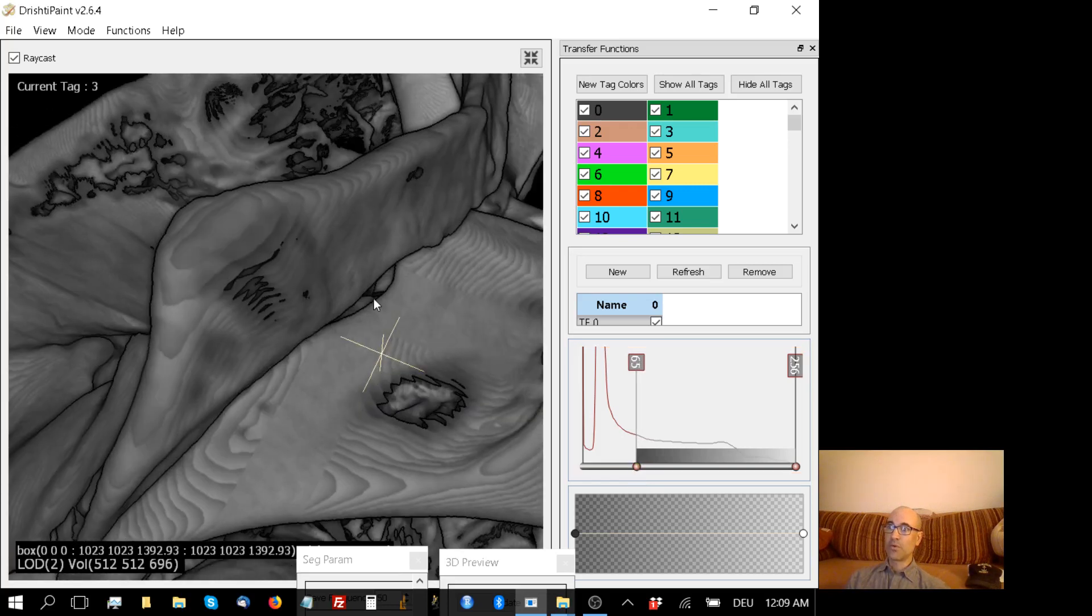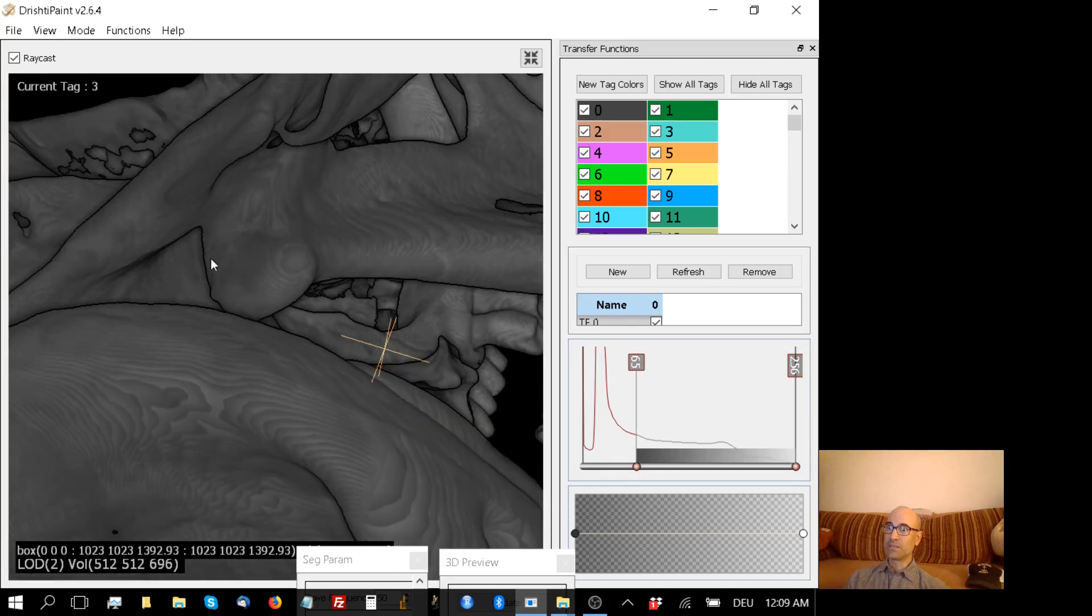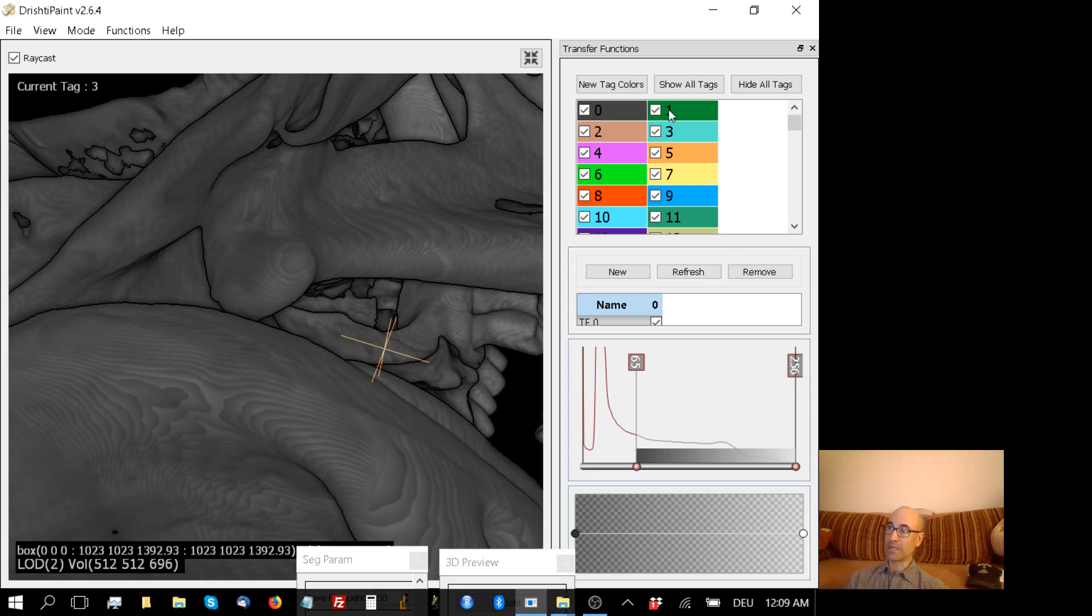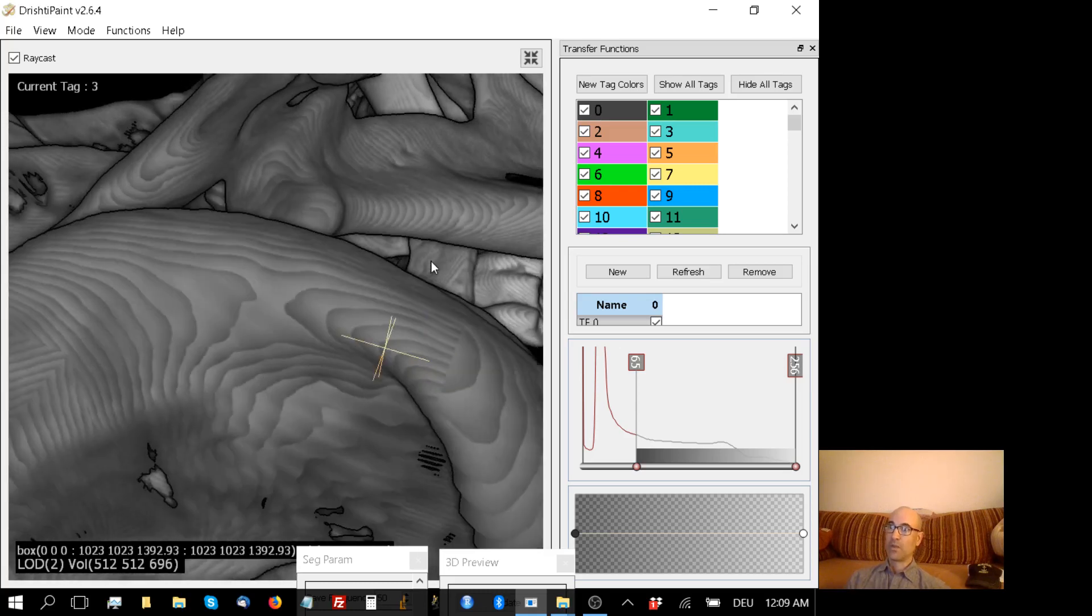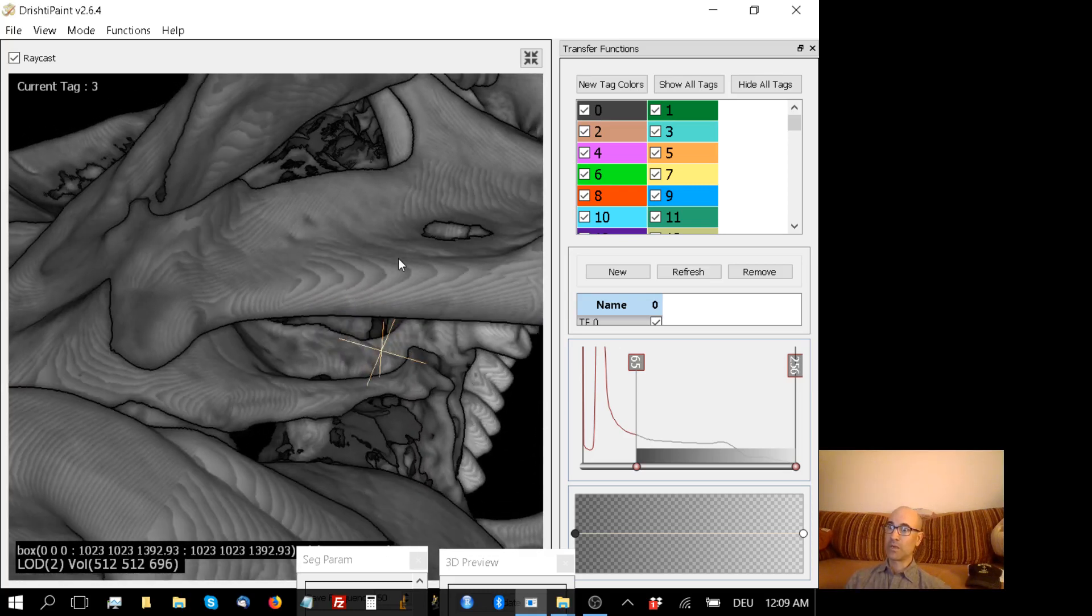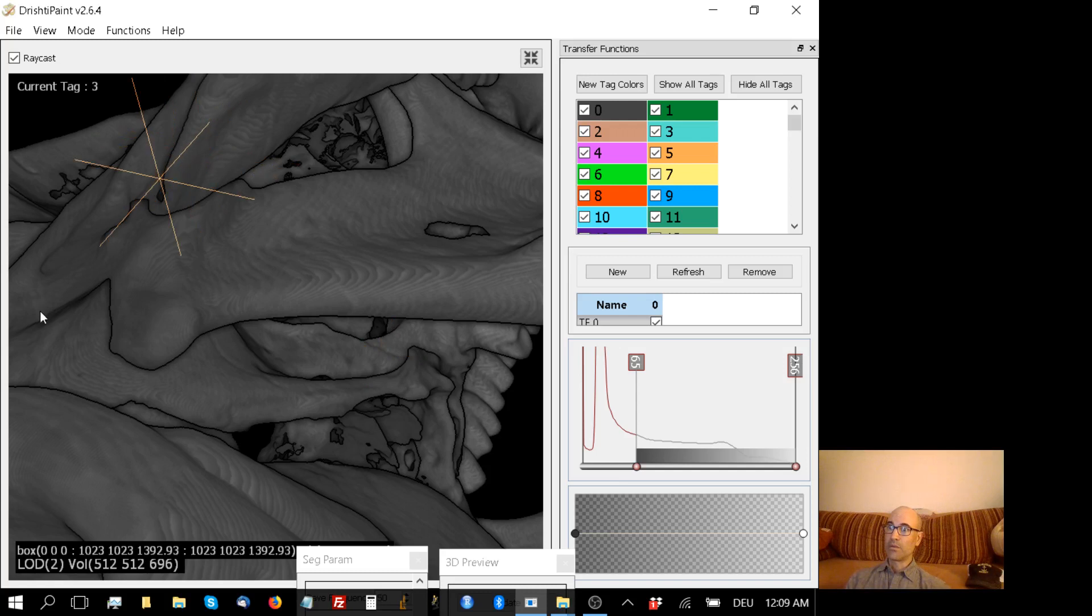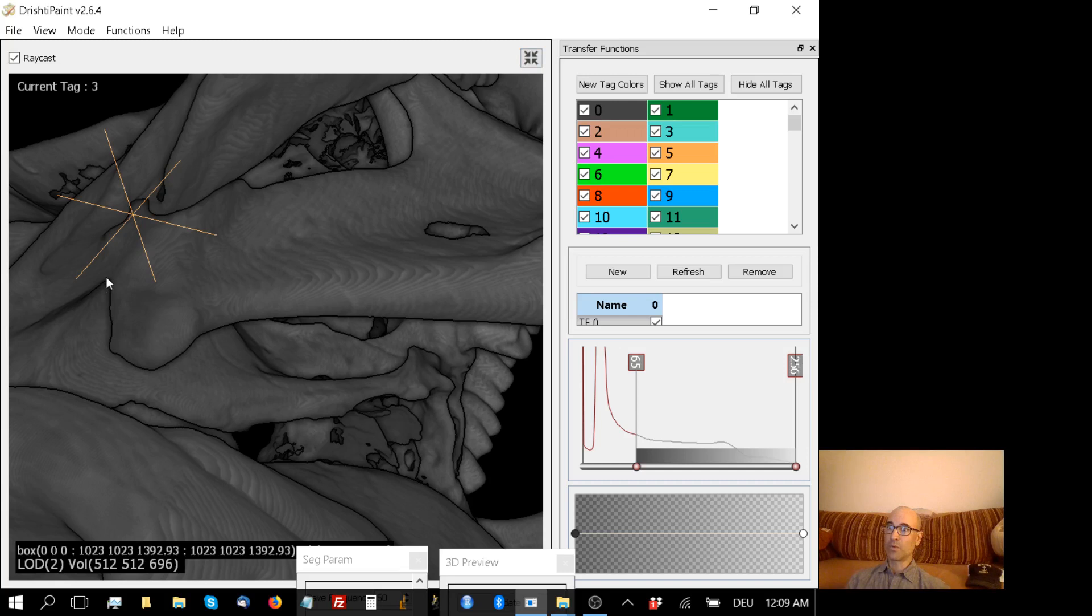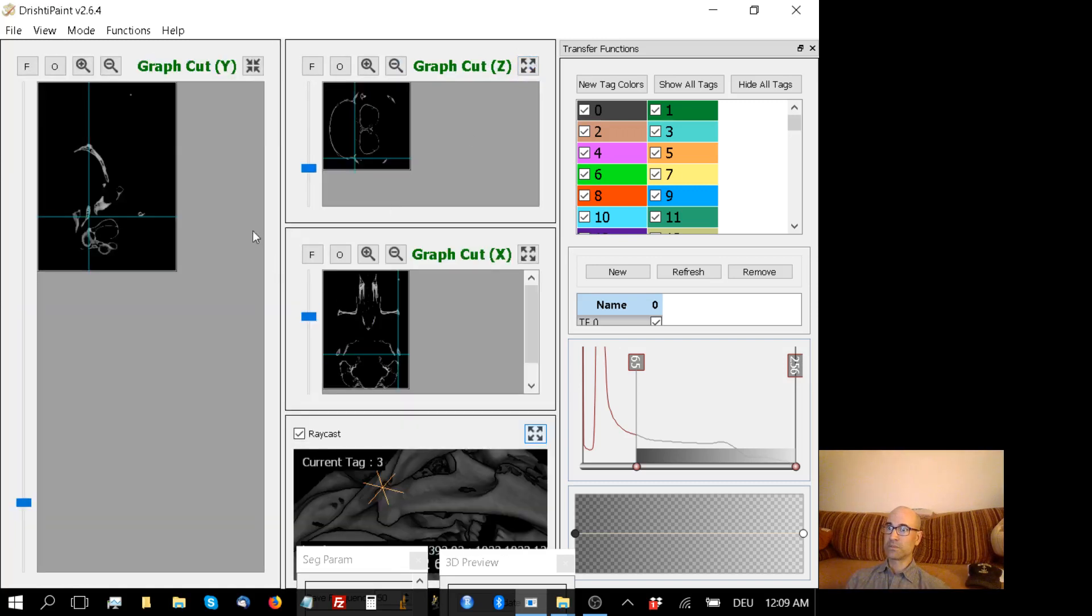So what I have to do instead is tag the squamosal part of this articulation with some other tag, say number 1, and then remove that so that the two things aren't touching. So in order to do that, what I'm going to try now is to get my 2D slice close to this region where we get squamosal and dentary running into each other.